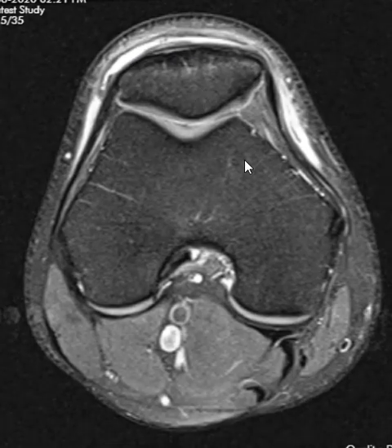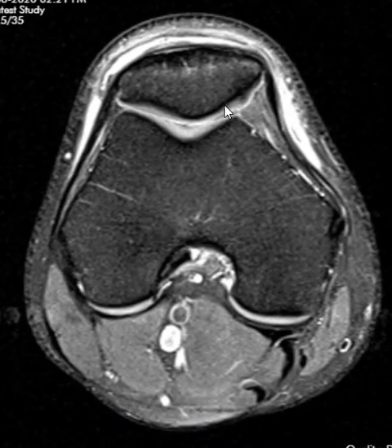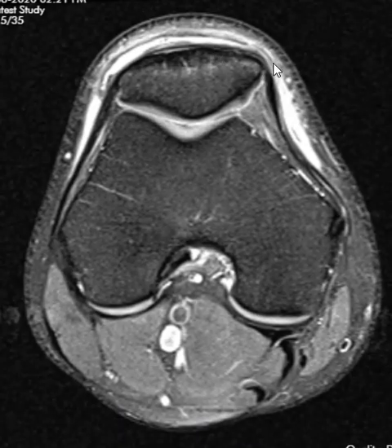So on this view we can see this big bone called the femur. Behind the femur are the calf muscles back here. The table the patient's laying on would be back here. Now the front of the knee is this direction, pointing upwards, and the kneecap is in the front right here, and in front of the kneecap we see the abnormal findings.